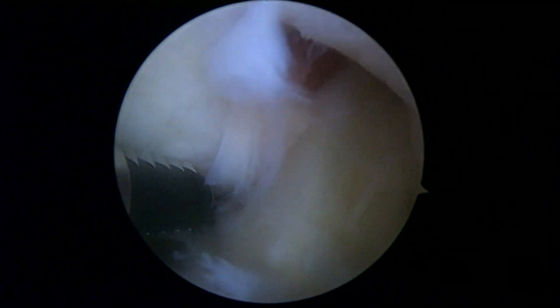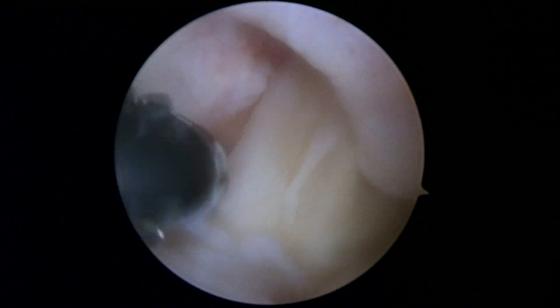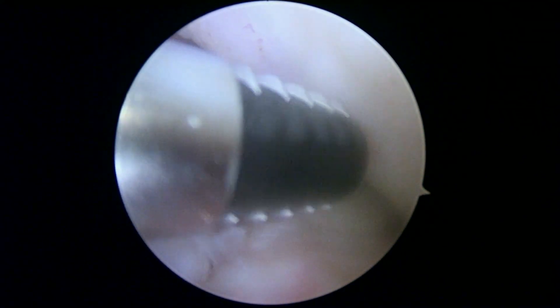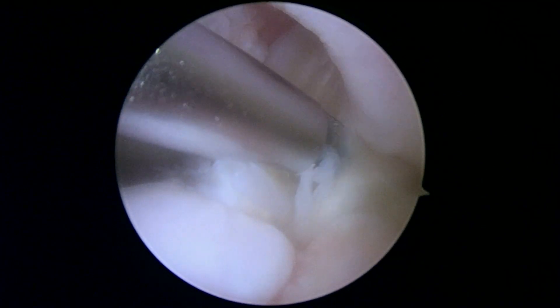We're going to take a look in the central part of the knee. Here's the graft and we know from your MRI scan the graft is intact, and here we can confirm that. So that looks pretty good right there.